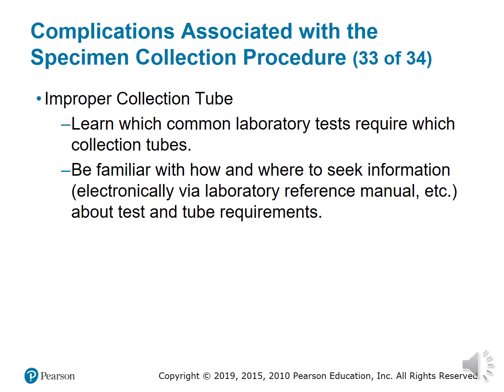When you are not sure about a lab test as to what type of tube needs to be drawn, there are reference labs on the computer that can help you. The most popular reference lab is Mayo Online. You just type in the name of the test and it will tell you what type of tube is needed for that test and how many milliliters is needed to have a successful test result.